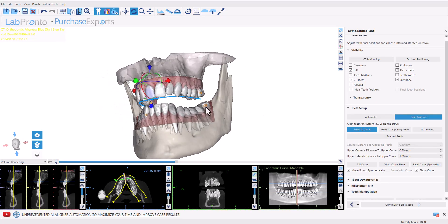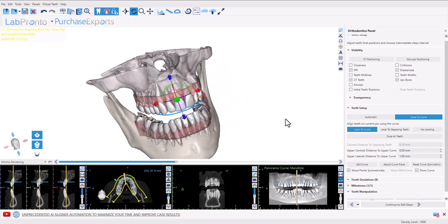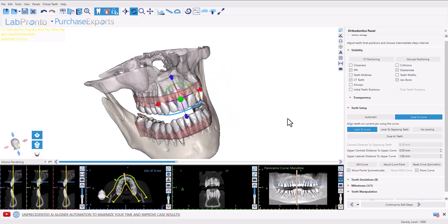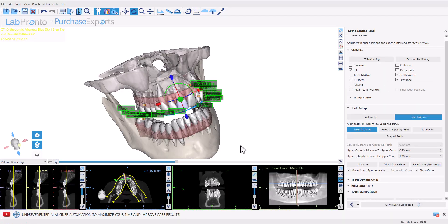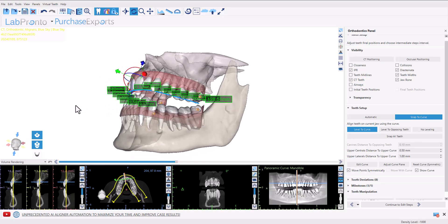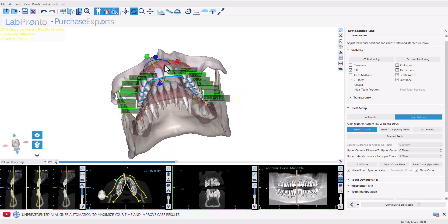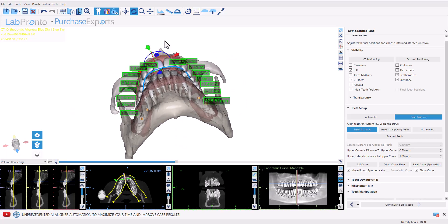Viewing the width of individual teeth is simply a click of a button. In the visibility panel, simply click the teeth widths checkbox. You can see that the width of each individual tooth now shows up next to the relevant tooth.